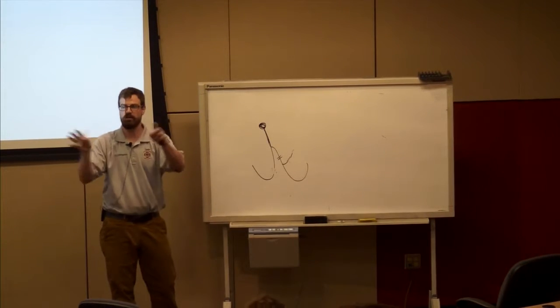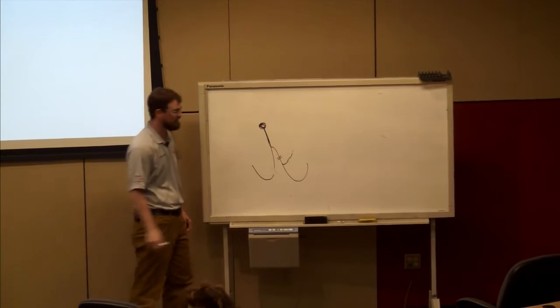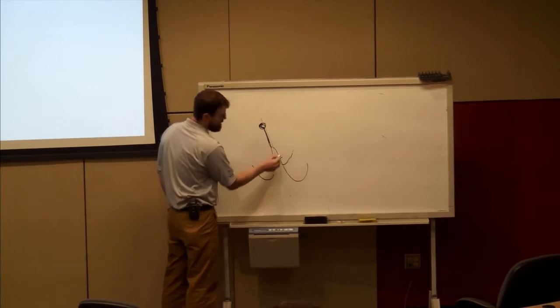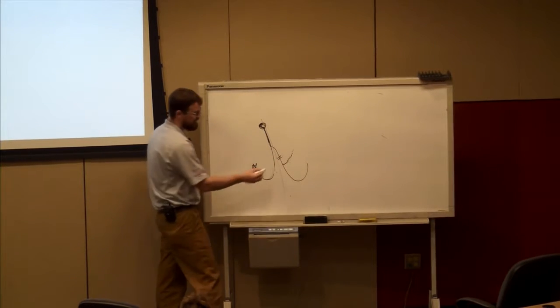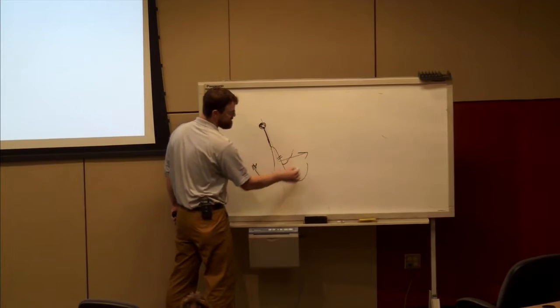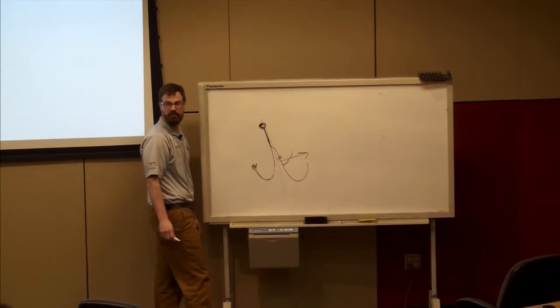The thing that's difficult to distinguish is that we pair right bundle and left bundle together because they give me a wide complex rhythm. What happens? I get a fast depolarization of this ventricle, but slow depolarization of this ventricle, so I end up with a wide QRS complex.